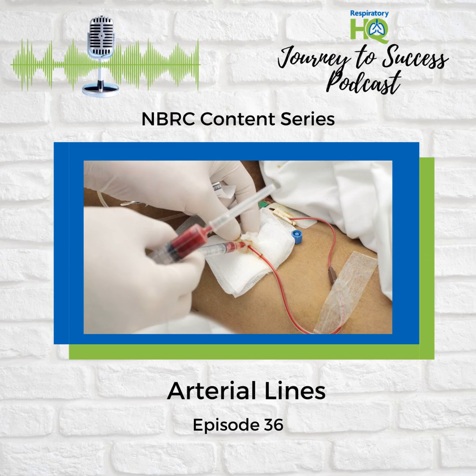It does. But, like we said, with great power comes great responsibility. Right. We have to use this tech wisely and ethically. Of course. Always putting the patient first. Couldn't have said it better. And speaking of that, maybe we should go back to informed consent for a minute. Yeah, good point. The source says there are no absolute contraindications for arterial lines.